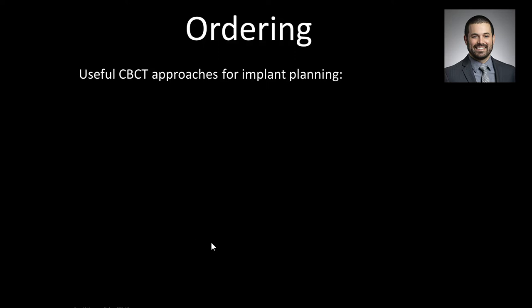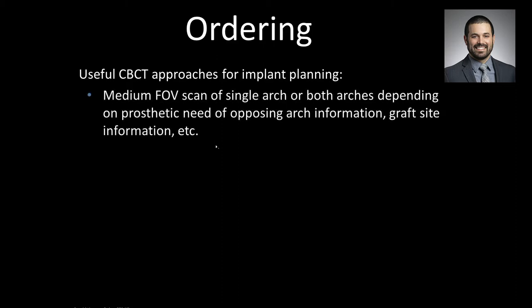What I'm going to be talking about is some different indications, so kind of patient reasons to acquire a cone beam CT, and what resolutions and scan times you should be looking at. So we'll start with implant planning. And the first thing we'll talk about is most implant planning cone beam CTs are medium field of view scans of either the single arch or both arches together, depending on the prosthetic need of that opposing arch information, obviously the planned implant sites, and then also any potential graft sites and information.